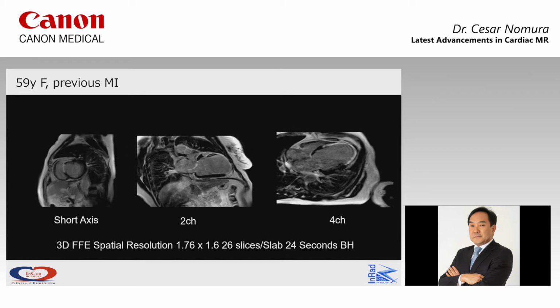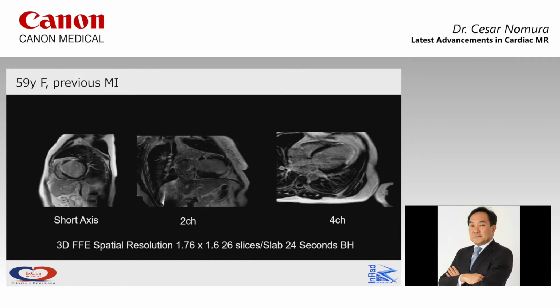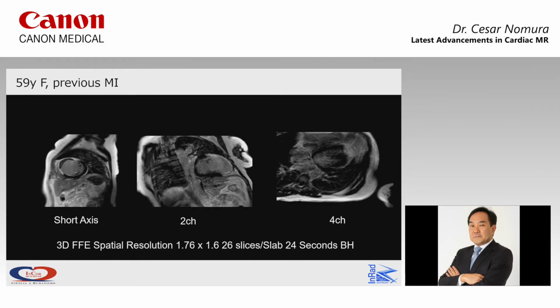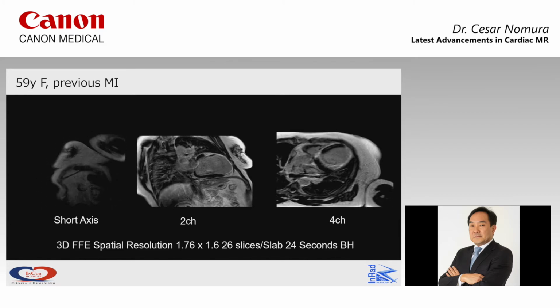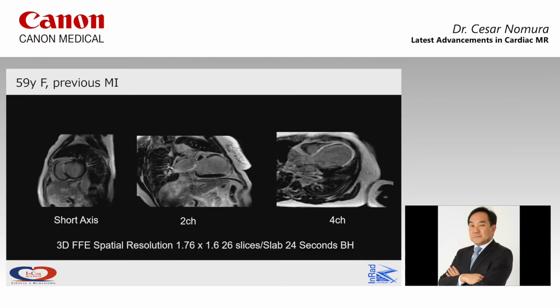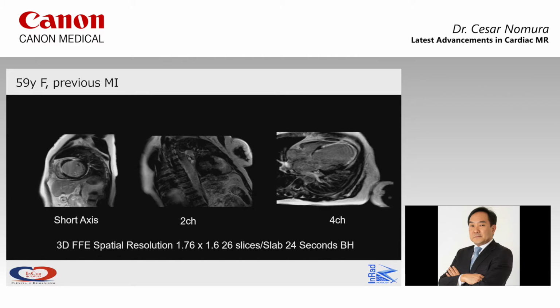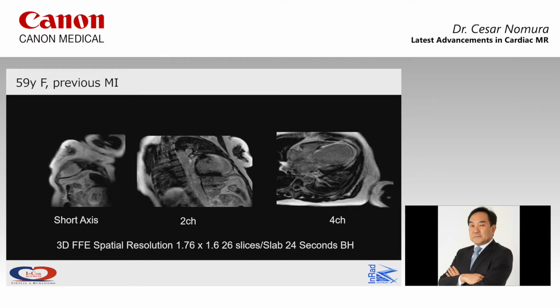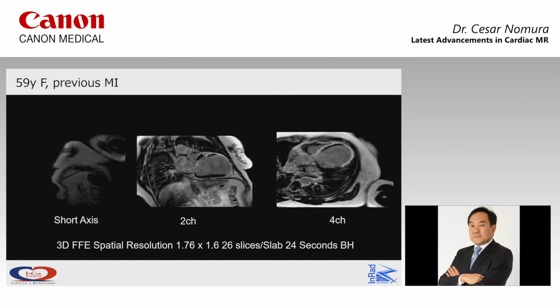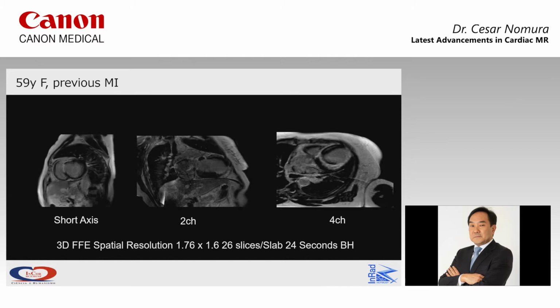What we are doing, we continue using 2D late enhancement, and we run at least the short axis. We didn't change just for the 3D. We're still using the 2D, but sometimes the 3D can help in the short axis, because we would like to see the continuity of the late enhancement, and sometimes we're in doubt about whether it is gray, whether it's really a late enhancement or not. So this is what we are doing. We include the 3D sequence in our acquisitions.